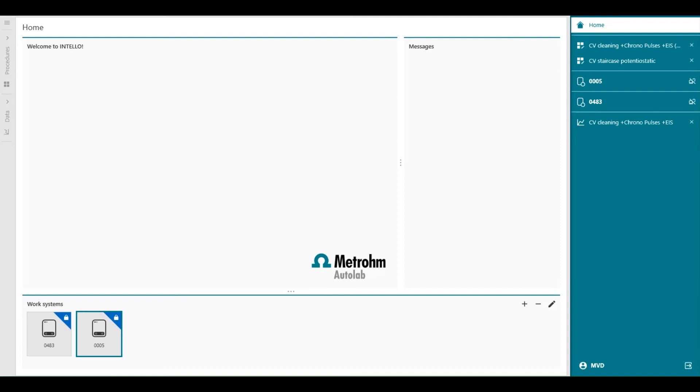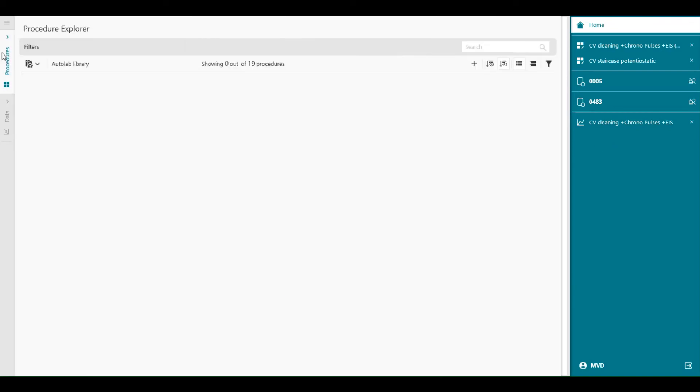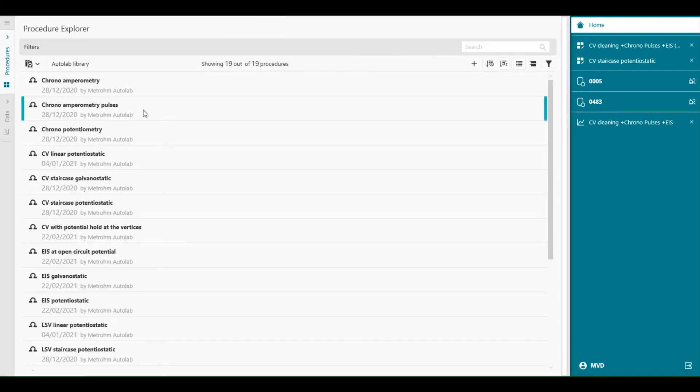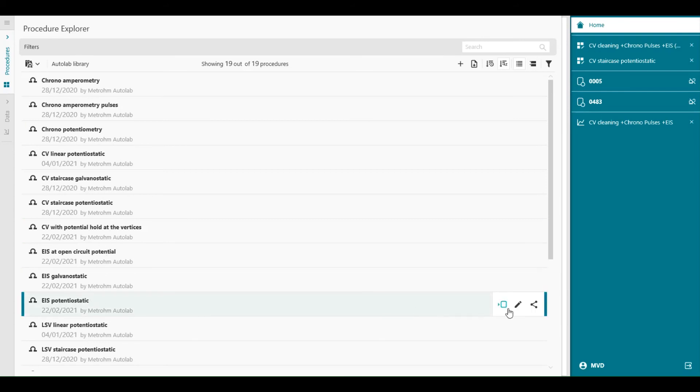So this additional work system now has its own section in the panel. Let's select a procedure to run on this section as well. So for example, we can select impedance measurement on one instrument. Let's take this one. We can assign for which number we want to measure.